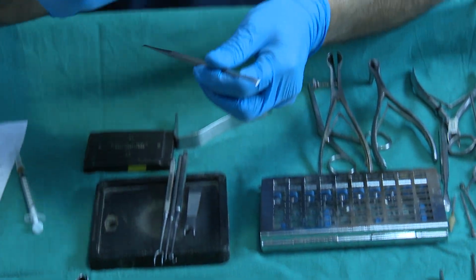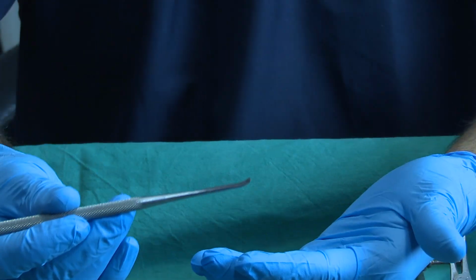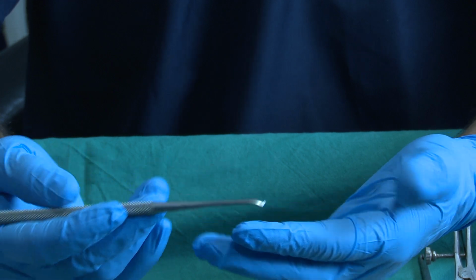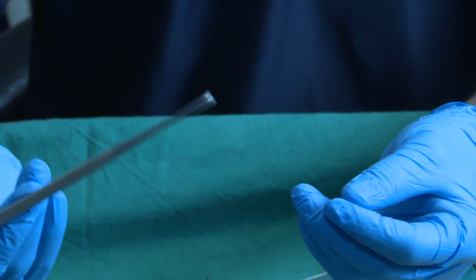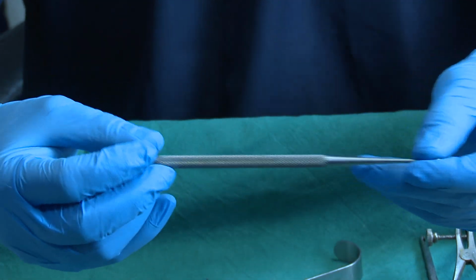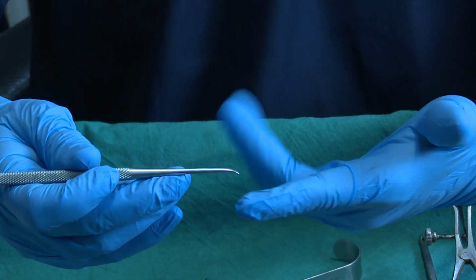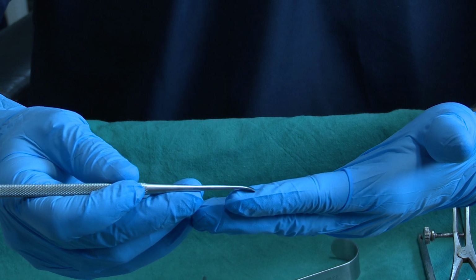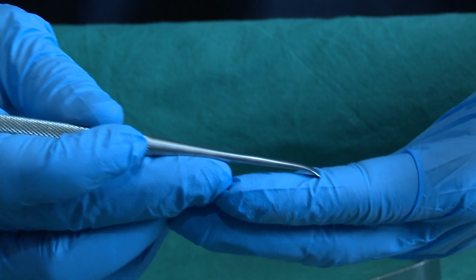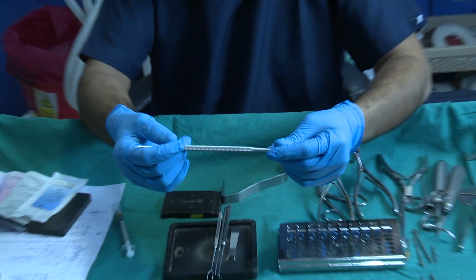After exposure, for lifting the soft tissue envelope over the lateral crus, we usually use this Kakir periosteum elevator. This is a type of elevator. We hook with this instrument and then expose both sides of the lateral crus. One side of this instrument is sharp and the other is a little bit blunt, but it's a good instrument, and you can lift up the soft tissue envelope from the mid vault, from the upper lateral cartilage, and also from the nasal bony pyramid.